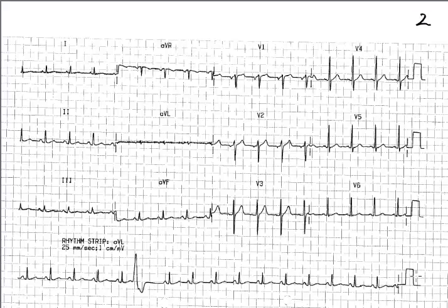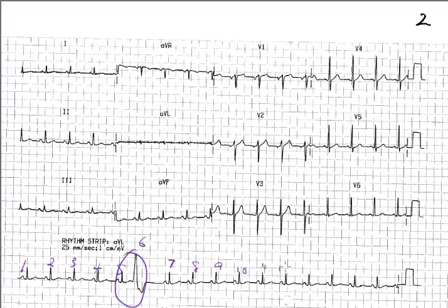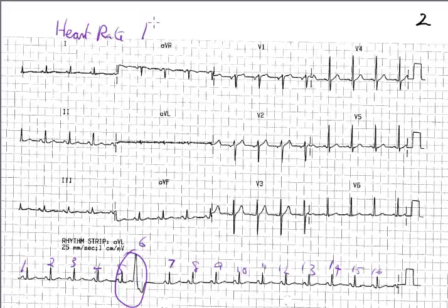So in this instance, we'll count them. Always count the ones that seem to be out of place. Counting all 16 QRS complexes along the strip, the heart rate is 16 times 6, which equals 96. You can check that on your calculator if you like.